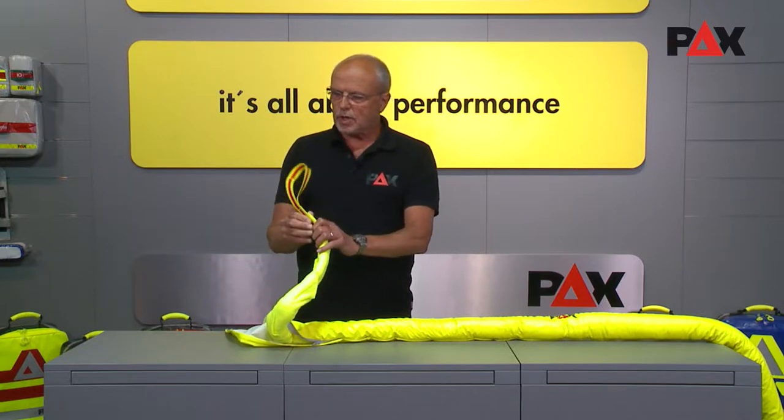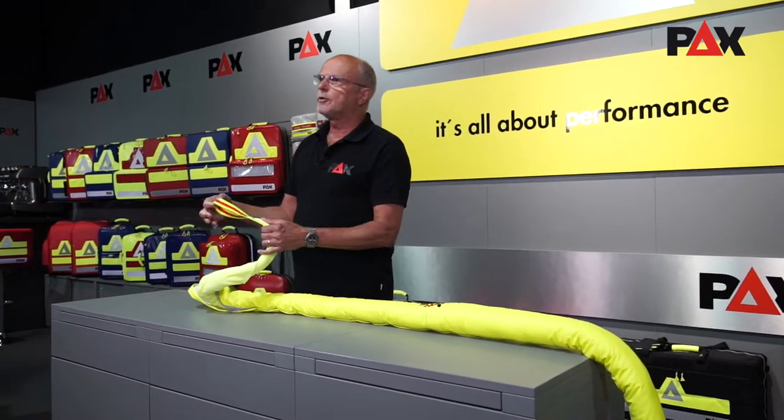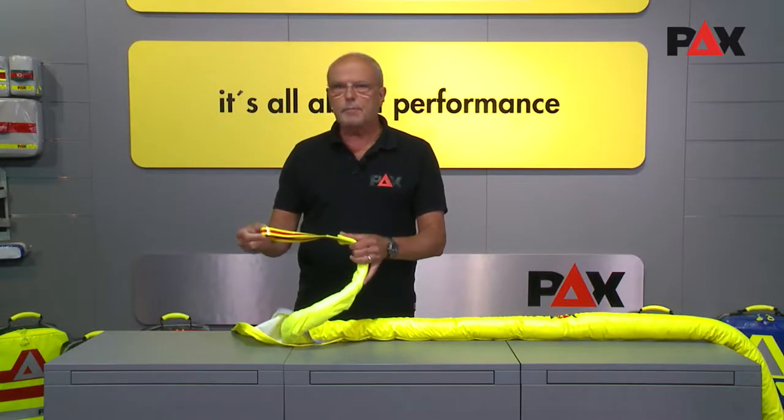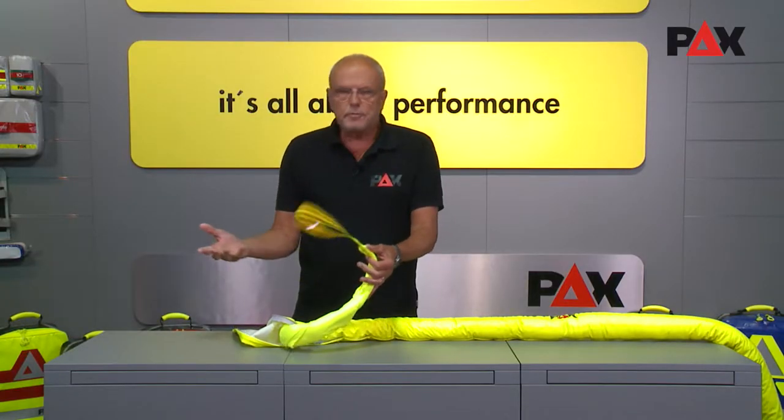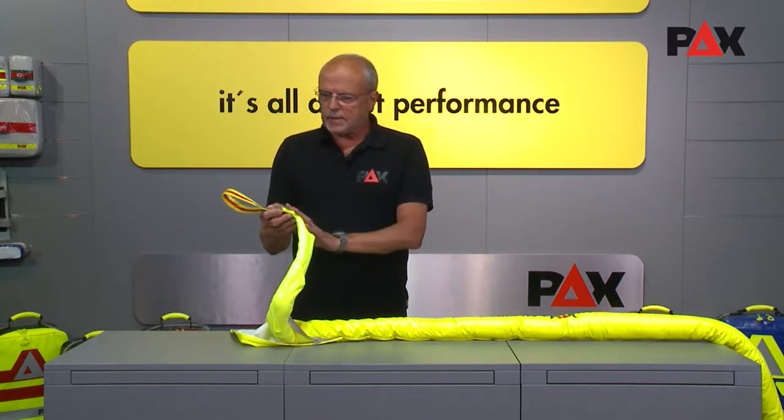The carrier material is a continuous belt system. The two ends are PU coated so that they cannot absorb fluids — blood, fuels, brake fluids, and all the like. The sealing is also easy to clean and disinfect.